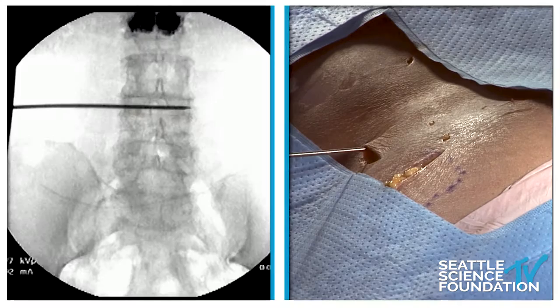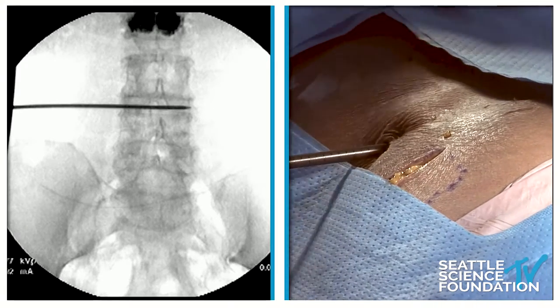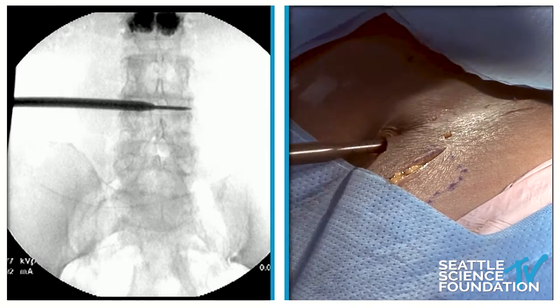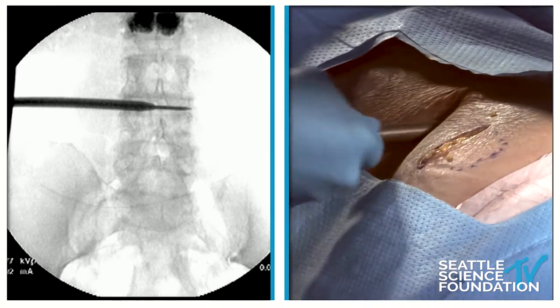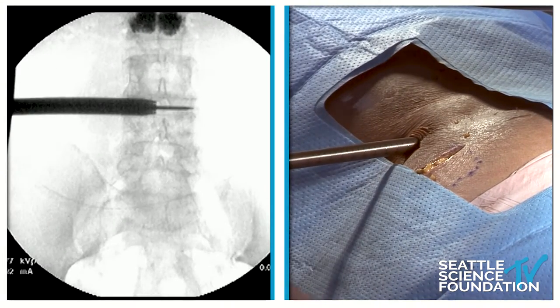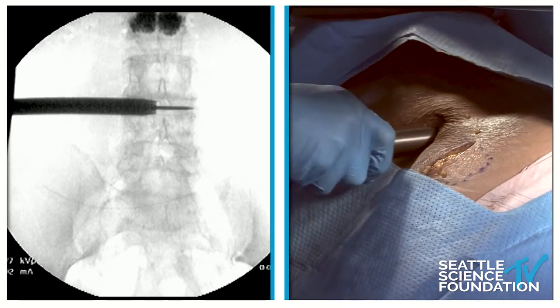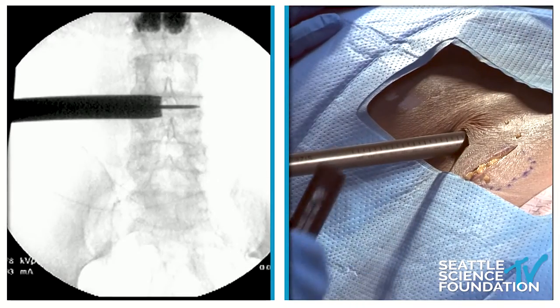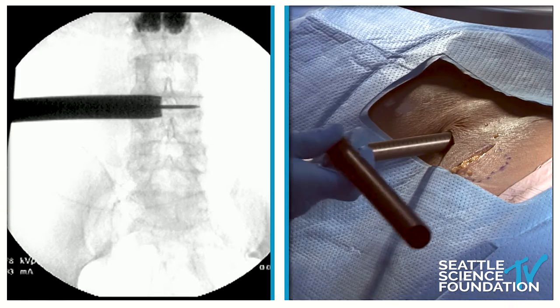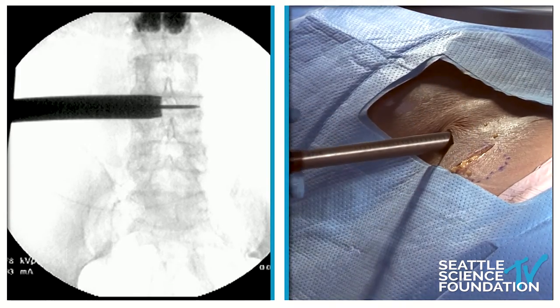Now we're going to start our series of dilations. We start off with the small dilators — these are tapered — and we'll see a series of dilation. These are the older style dilators that are a little bit more radio-opaque, which is better. We'll dilate all the way up to the 20 millimeter. Here's the progressive dilations — this is sleeve one, so this is 20 millimeters.